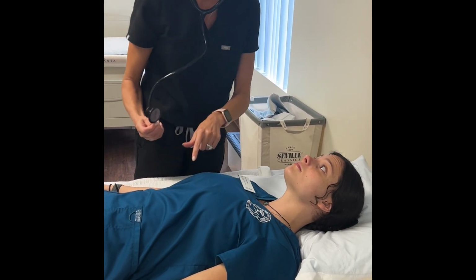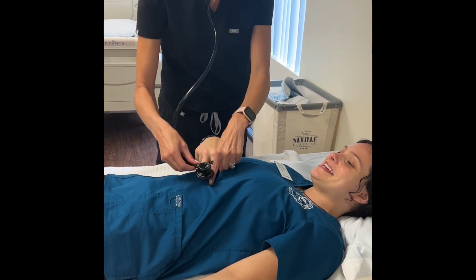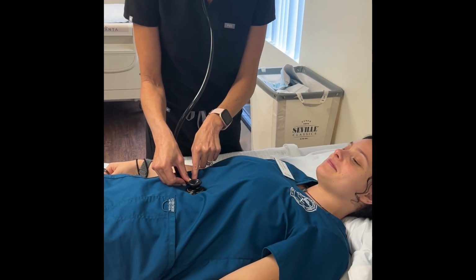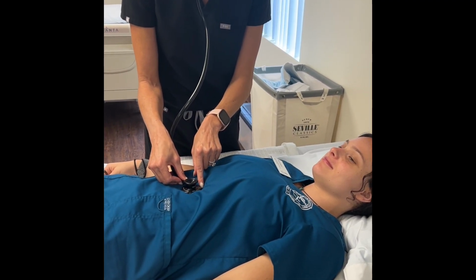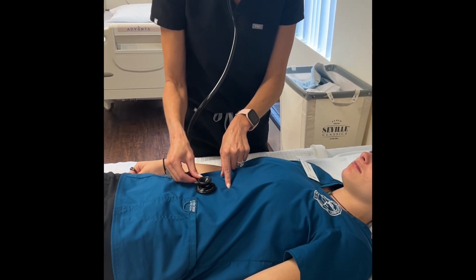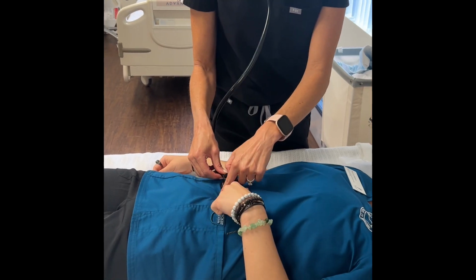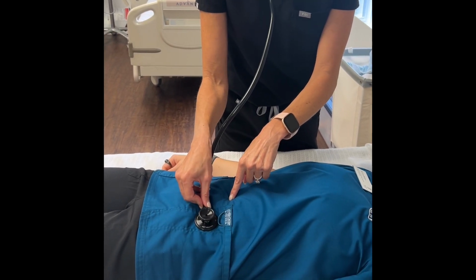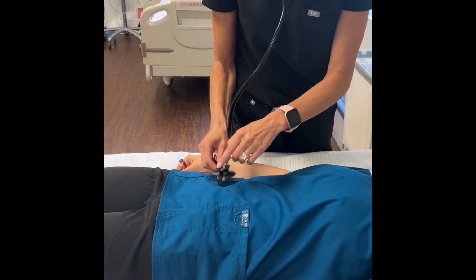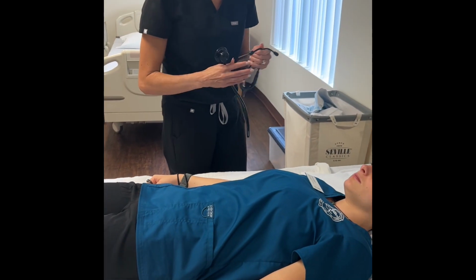Could you point to the end of your sternum? Sternum. Oh, my bad. Thank you. Okay, and right below that is the aorta. Again, listening for bruit, which is a turbulent sound in an artery. Left renal. Right renal. Point to your belly button. 45 degrees iliac, left iliac, right iliac, and stating femoral. At all of those locations, I did not hear any bruits, which is a normal finding.